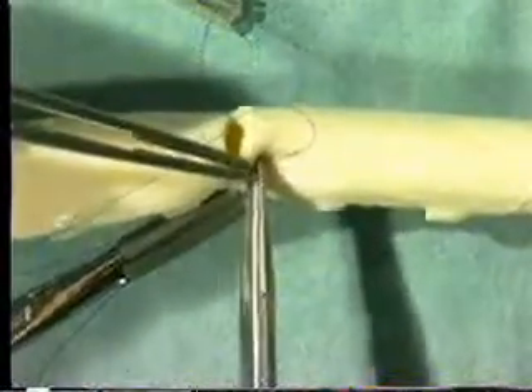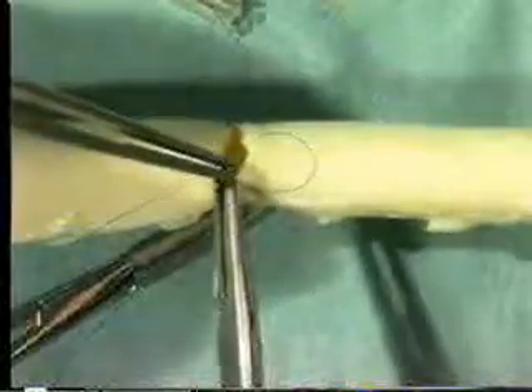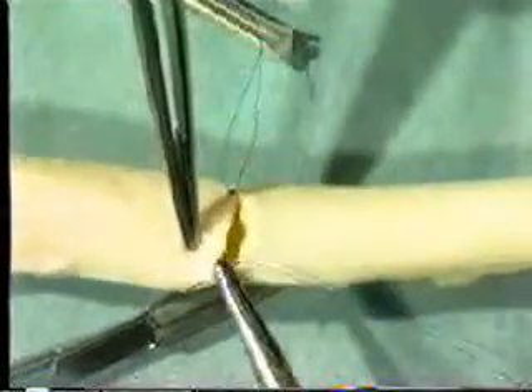Take the other needle and begin suturing from outside to inside on the upstream side of the incision, then suture from inside to outside on the downstream part of the incision. This is because intimal dissection is most likely on the downstream side once blood flow is restored. It is essential that you have an assistant to follow the sutures to ensure that correct tension is maintained.